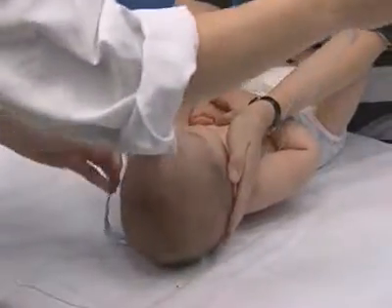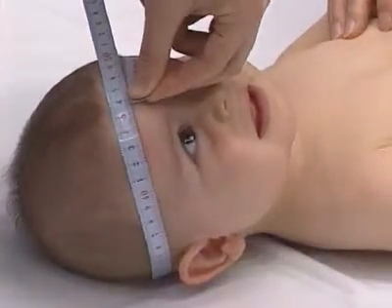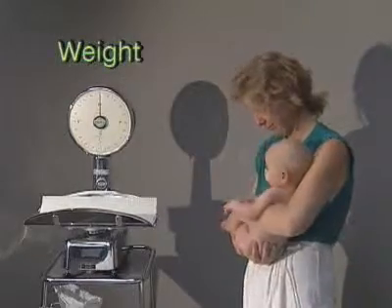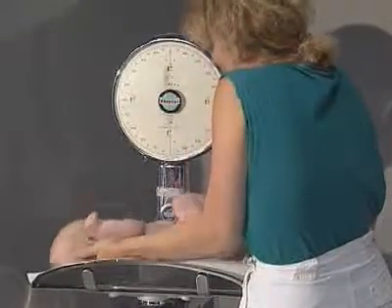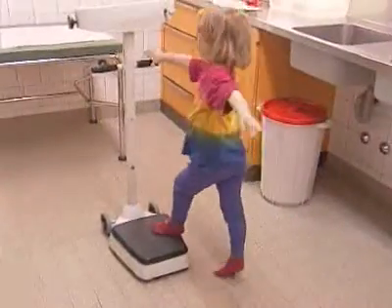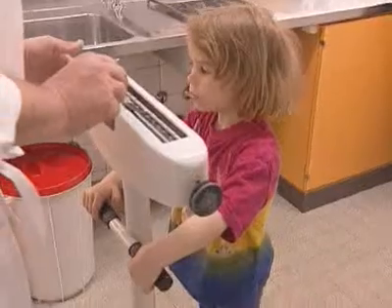When measuring the head, take the widest occipito-frontal circumference. Babies are weighed unclothed on a scale pan. The scale pan must be warm so as not to startle the baby. Older children are weighed standing on normal scales.